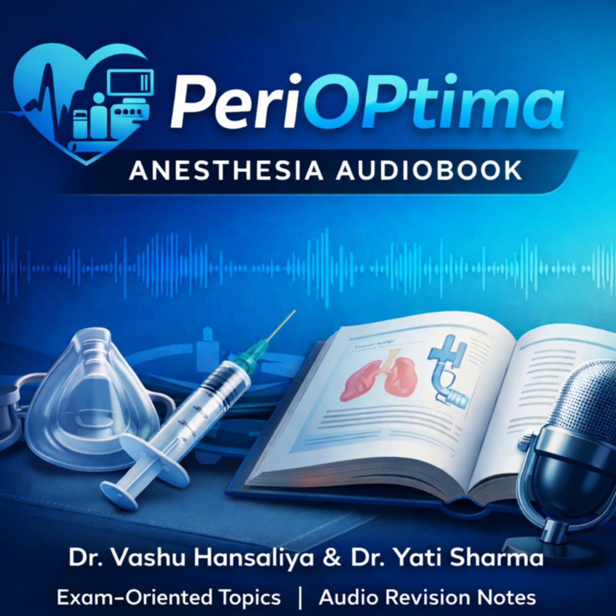If you choose volume control, you are telling the machine, deliver this exact volume and this exact flow. The machine does it. But because the equation must balance, pressure becomes the dependent variable. Meaning it will just go to whatever level it needs to. Exactly. If the lung gets stiffer, the pressure will go up to deliver that set volume. Conversely, if you choose pressure control, you tell the machine, apply this much airway pressure. The machine does. But now, the volume is the variable. Precisely. If the lung gets stiffer, that same pressure will now deliver a smaller volume. Understanding that one trade-off is the difference between passing and failing this topic. Okay, that's a huge concept.